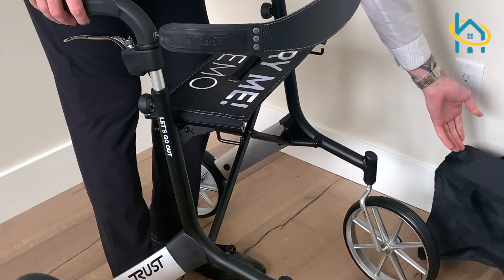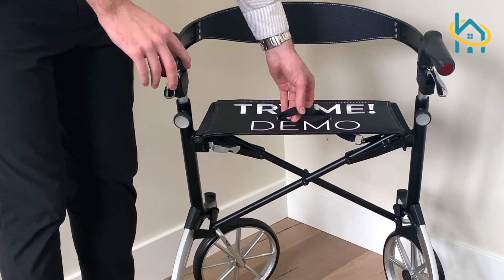To collapse your rollator, simply pull up on the handle located on the seat and fold it away.